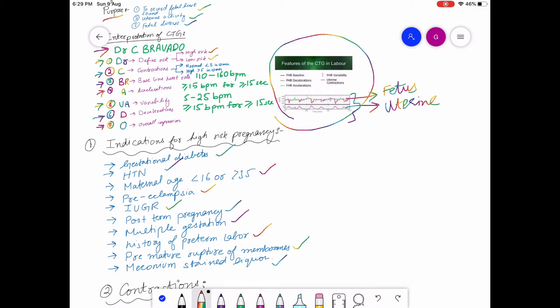The second point is contractions. Contractions are normal if there are fewer than 5 in 10 minutes, and high if greater than 5 in 10 minutes.